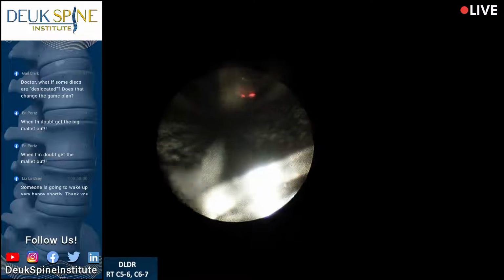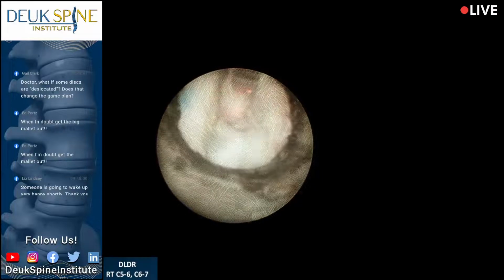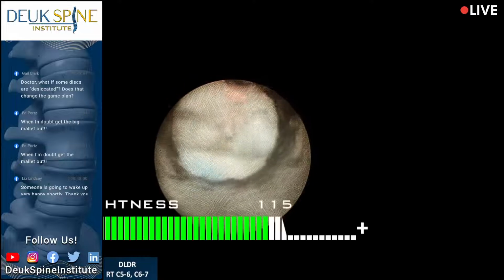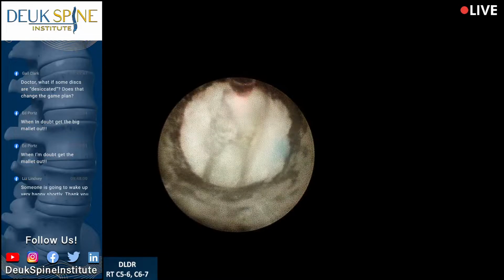So far that's 2. Guys, it's a little bit overexposed. If we can turn the brightness down a little bit. And you can see another herniation there and another one there. On the top. There you go. Perfect. I think maybe that's good. Let's see how that goes.